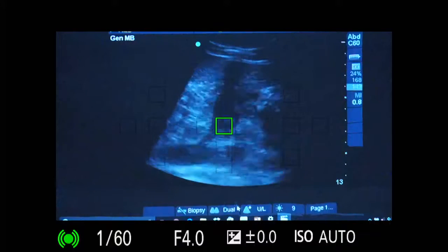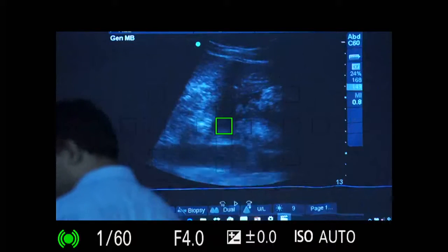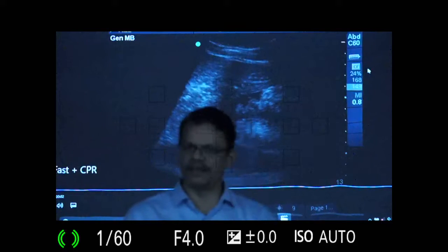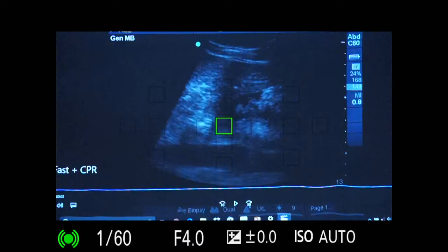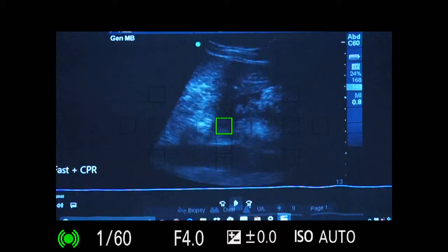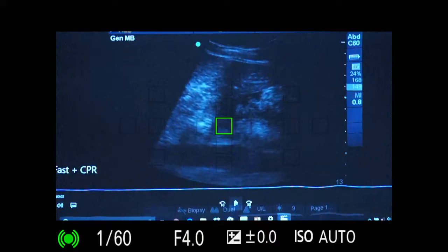Come on. No, no, wait. Huh? So, yes, the ongoing CPR. See, it is rhythmic. Here we have not stopped the chest compression, and this is one more situation where you need not stop chest compression and can continue doing ultrasound, because you are away from the people who are doing chest compression. आप तो नीचे खड़े हो, near the abdominal area, you can still do all the scans. So, that is why the chest compression is going on.